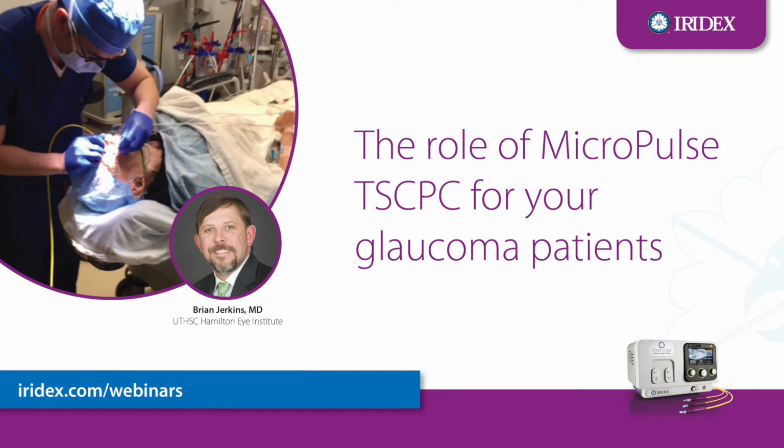The patients that do fail, or whose pressure starts to trend up over time, I do take that on a case-by-case basis. I have repeated MicroPulse before. I really don't like to repeat it quickly. I'm a little conservative. My general rule is I try to wait at least 6 months, but I have repeated it on a few people in the past. And I do take that on a case-by-case basis, but most of the time they do fantastic, and I just follow them as I would any other procedure.